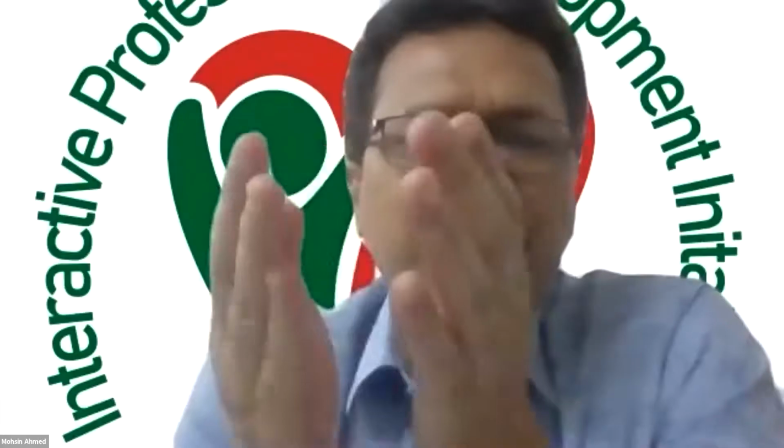But those who are very comfortable with torque, for them it's okay. But those who are starting with CTO and those who are newcomers, I usually tell them to feel the tactile response, especially for CTO. Then it's better to turn off the torque and go with your own finger feelings. Not for other PCIs. You can use torque.